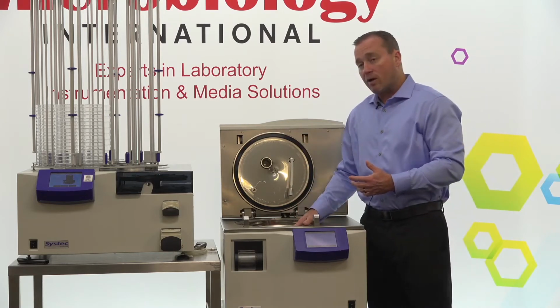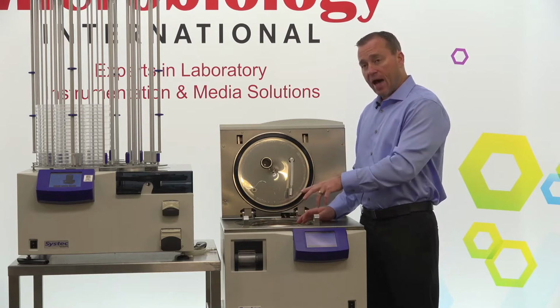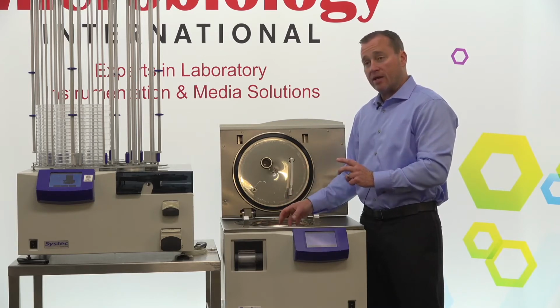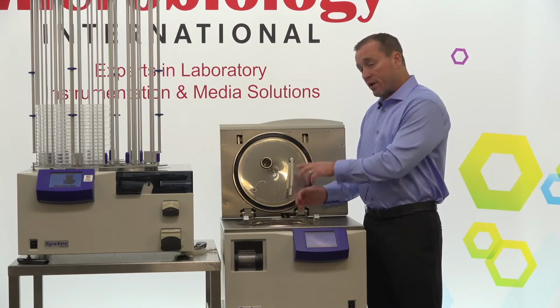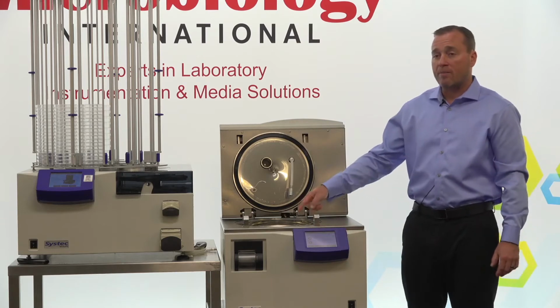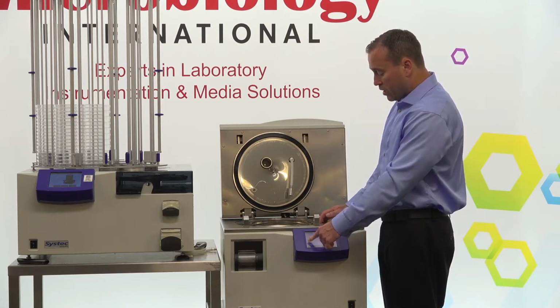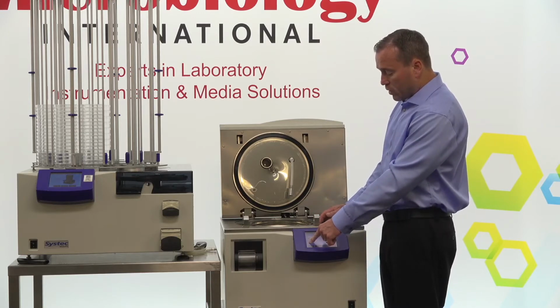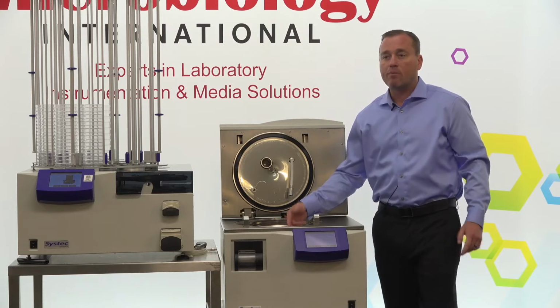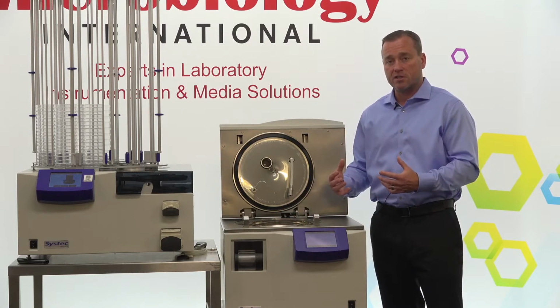When you would add components to this bucket, the way that we would do that is we would add half of the water. Once that half of the water is in, we would add any powder components that we have, rinse that out with the rest of the water, and I can also stir this while it's actually open. So you can hear that stirring mechanism work right now. That is adjustable as well, so I can adjust that stir bar. The stirring can happen with water in there and start to put all of the powder into suspension.